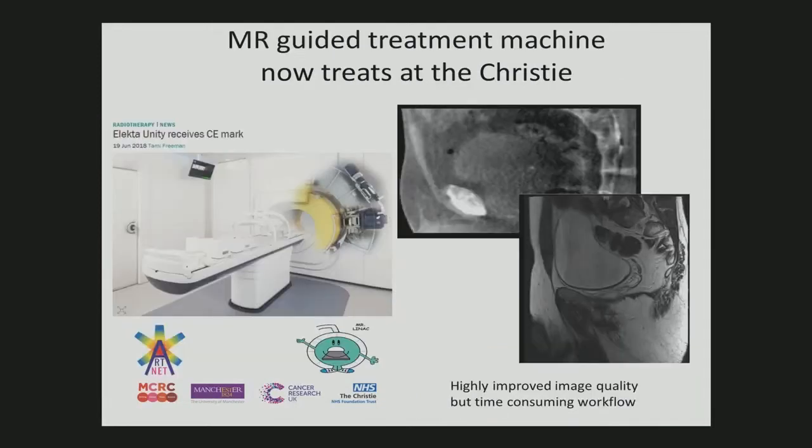So the newest kid on the block is MR guidance. And this actually came from another Dutch center. I worked in Amsterdam before, and I did that work in Amsterdam. This came from Utrecht. And they had the crazy idea to integrate an MR with a linear accelerator.